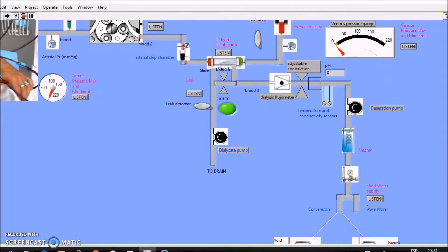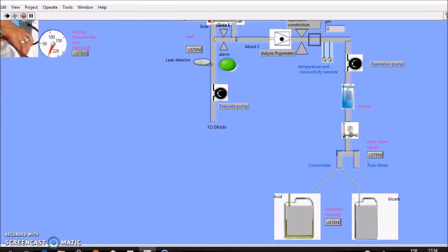Short water supply. Possible cause: occlusion of water supply filter, folding or occlusion of water supply line, leak from water supply system, water supply stop. Action: clean the filter or replace it with a new one. Repair leaked site. Operate water supply equipment.